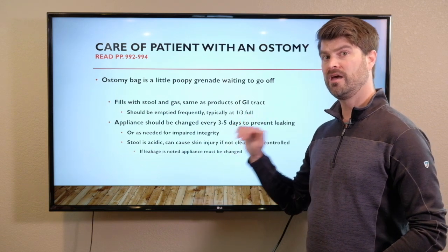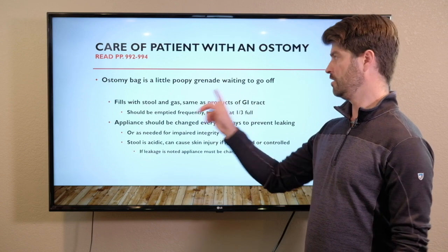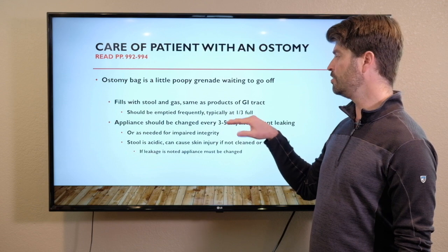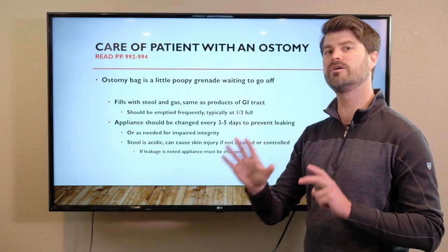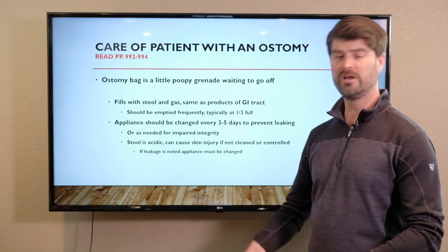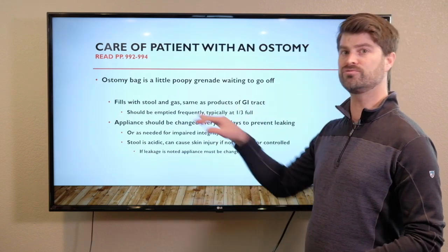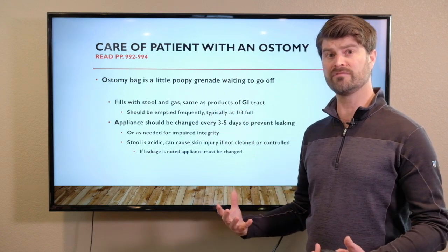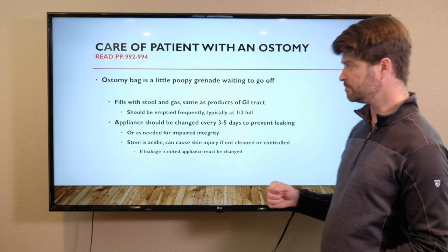Rule of thumb, never wait till they're full. By the time it's full, you are in the danger zone. This thing will blow up on you. About a third full is like entering danger zone territory. If you go in and assess a patient and it's about a third full, just go and empty it. That way you're saving yourself and your patient from the trauma of having a bag of stool explode all over their abdomen, which is really, really unpleasant.